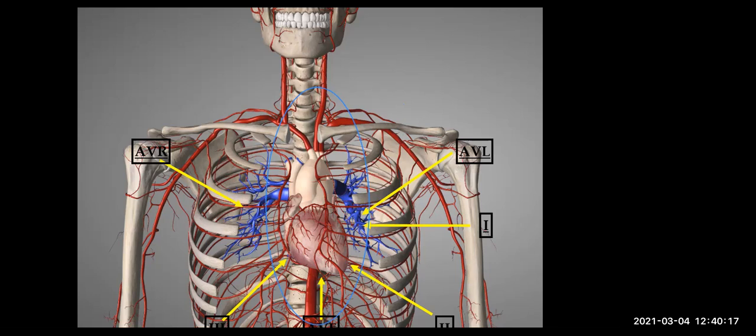All right. So let's put something on there just to make it a bit more apparent as to what we're talking about. So for example, AVL kind of sits more or less at the top here where it's showing in there. And lead one sits there. So you can see the two of them are looking at a similar part of the heart, whereas leads 2, AVF, and 3 are kind of looking at this side of the heart. And then you've got poor old AVR just on his own or her own, sitting on that side. Okay. So these are kind of like looped around the heart in that direction.